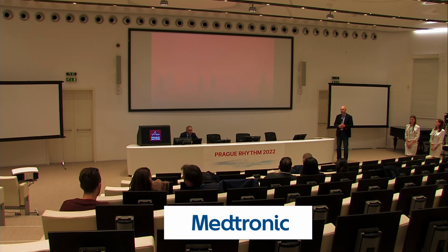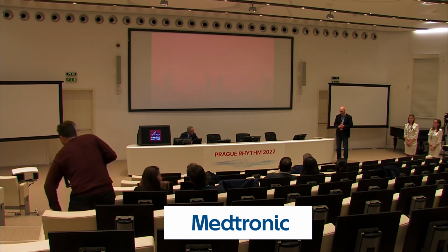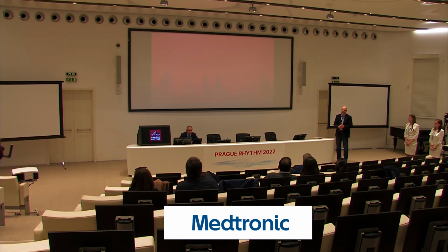The comment about this was the case with this coronary artery damage during the CS ablation. It was not done for WPW ablation, it was done during a different procedure. It was a cardio-neuro ablation, where some ganglionated plexi were believed to be close. It was a young, tiny lady. And I believe the risk of damaging these arteries was there, and it was a very terminal branch. So I believe the risk is higher if the vessel is tiny.